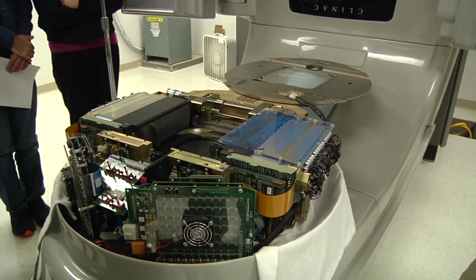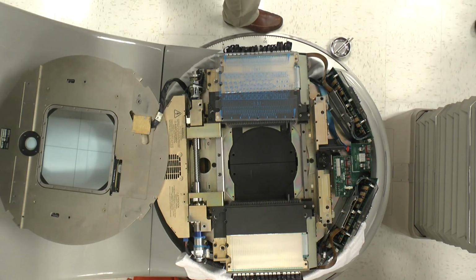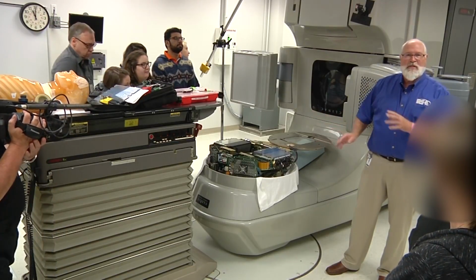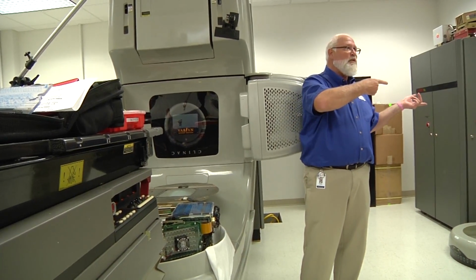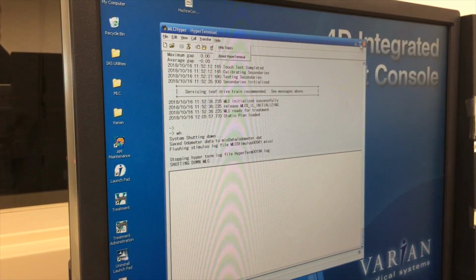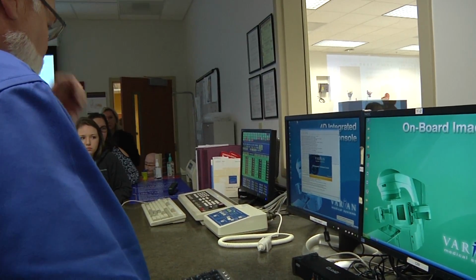then go initialize. So who knows how to initialize an MLC on the hyperterminal? Okay, this is version 7 or above software. So with that version, there's a shortcut. It's called WR. And we'll go in the room. We'll see what we have to do to initialize. So this is hyperterminal.